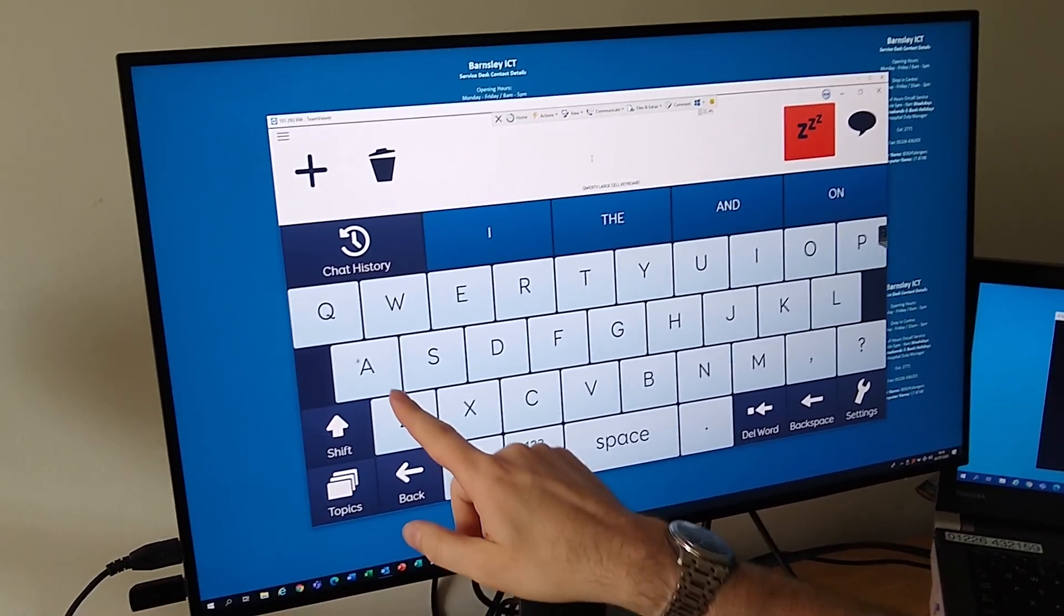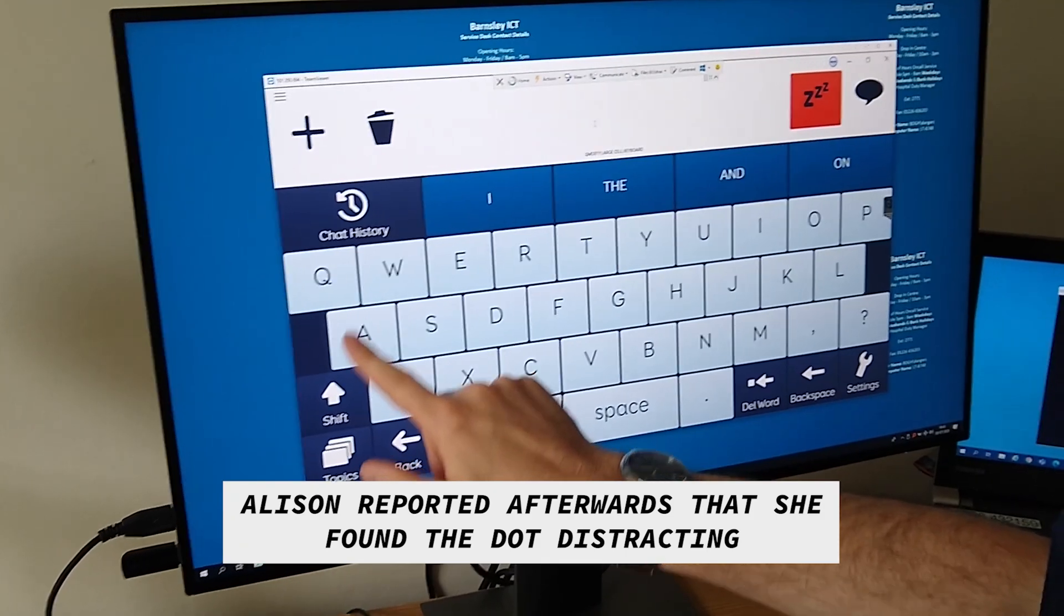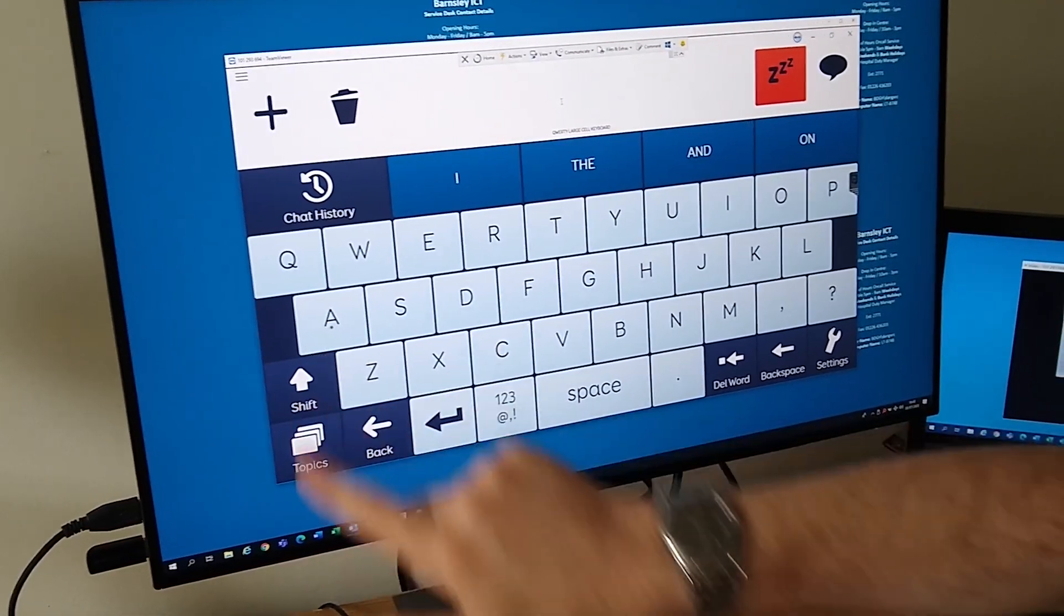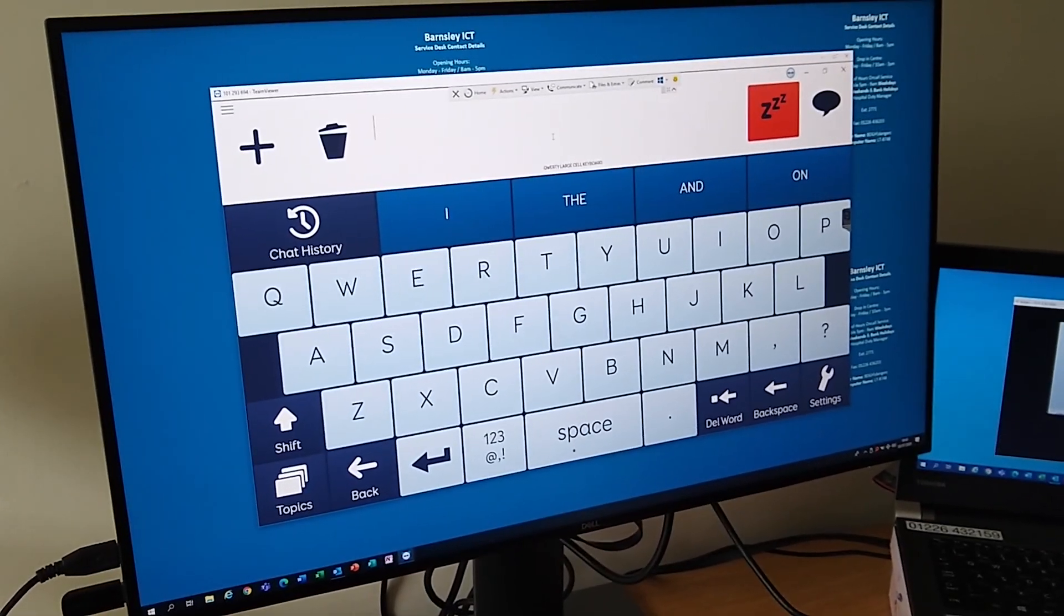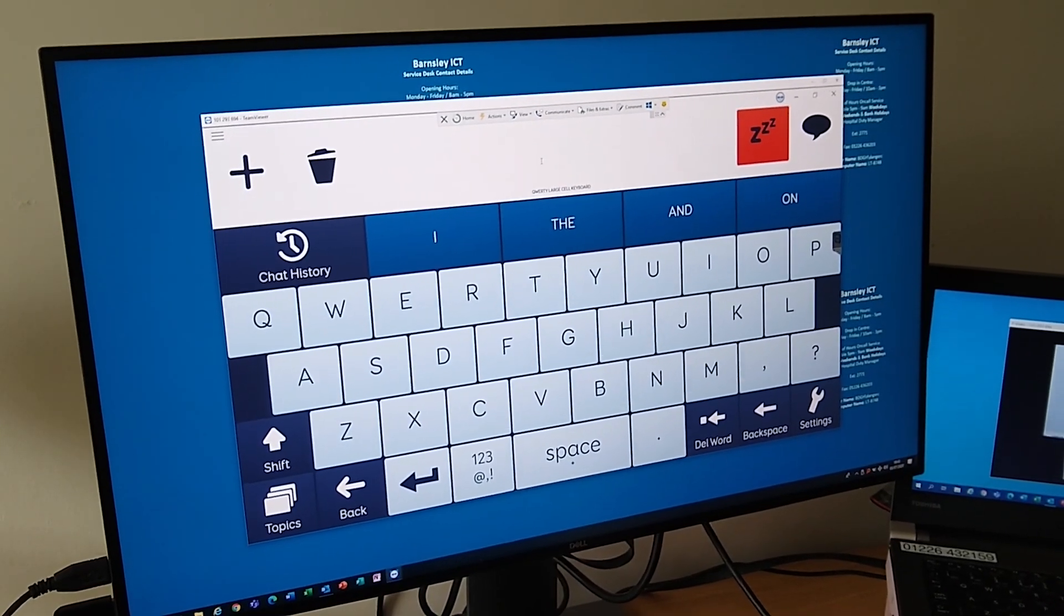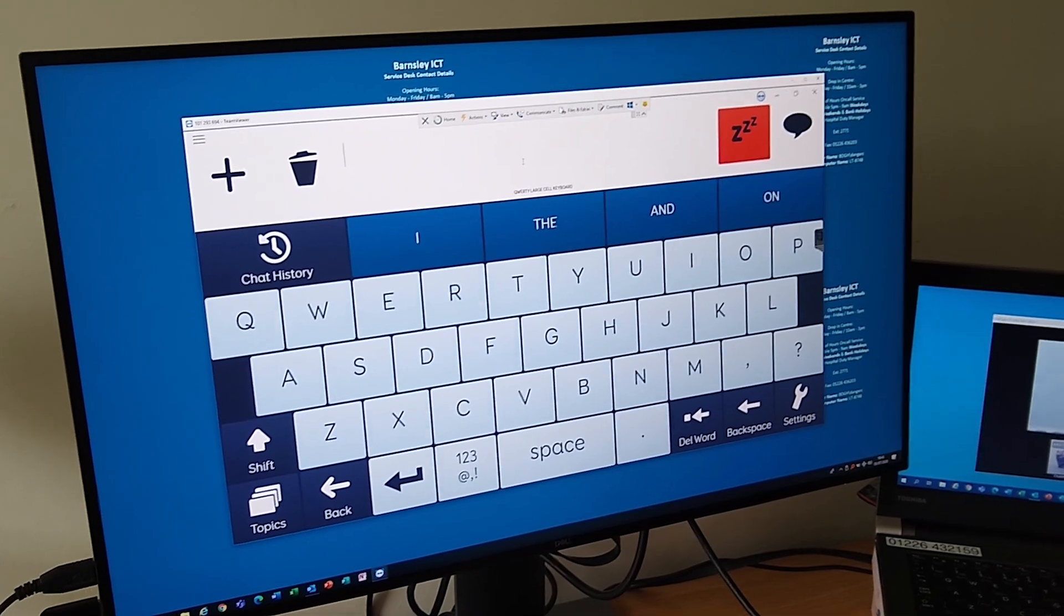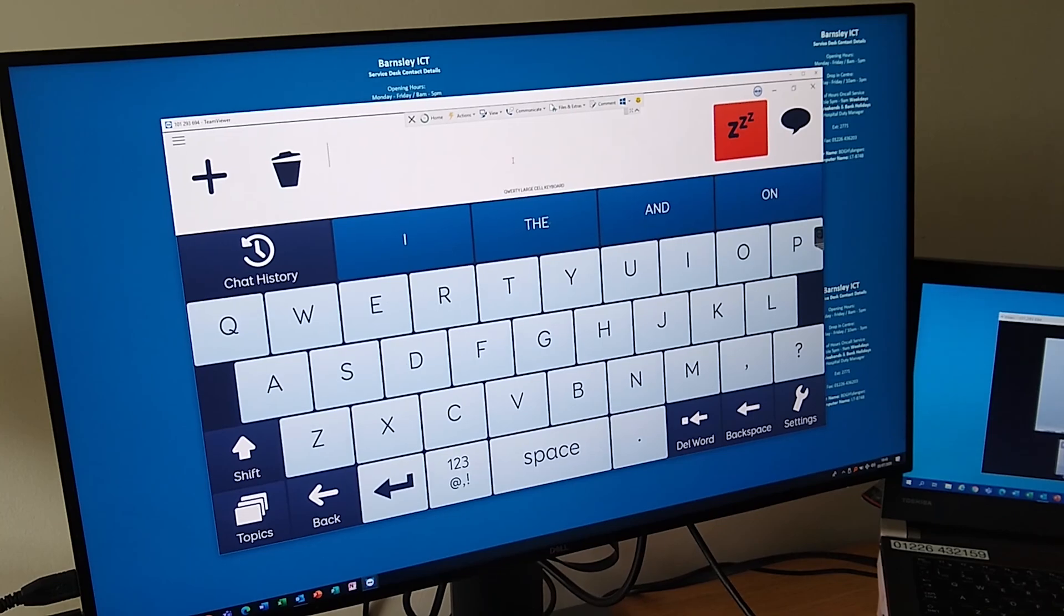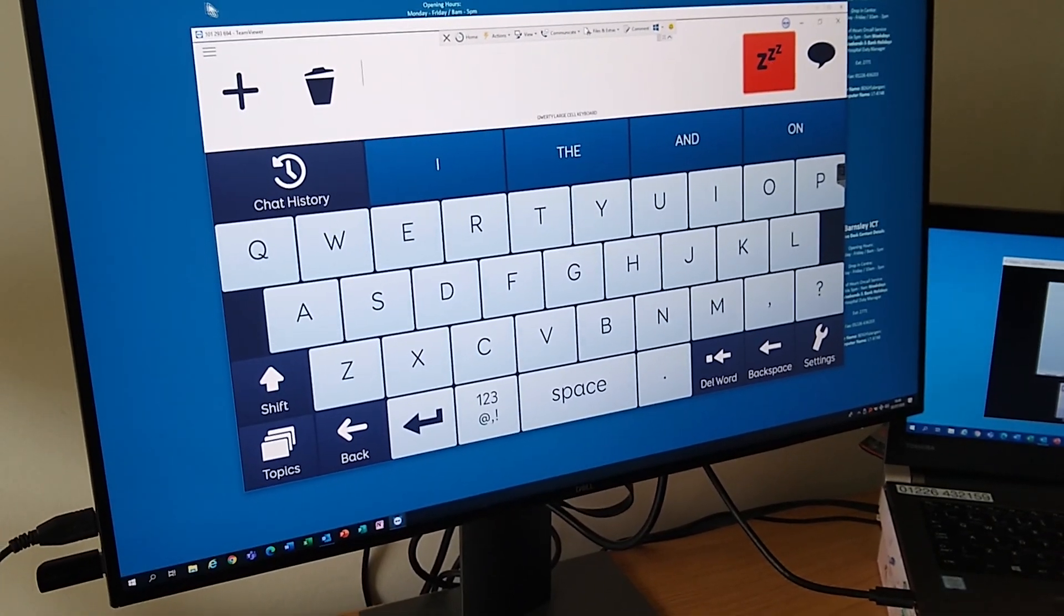This maybe is not quite so accurate, so we could perhaps try and recalibrate or we could have a look at something else or maybe change the position of the camera. That's really nice, okay. The space bar in the middle—can you have a look right in the middle of the space bar? And then I want you to go up to the word 'the' in the prediction. Great. Try and have a look at the word 'the' right in the center there. Okay, Alison, that looks pretty accurate.